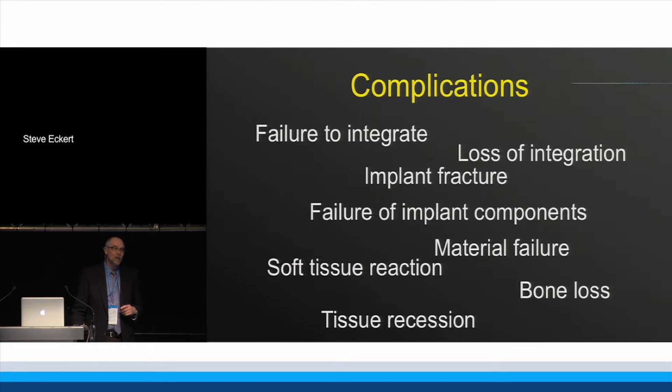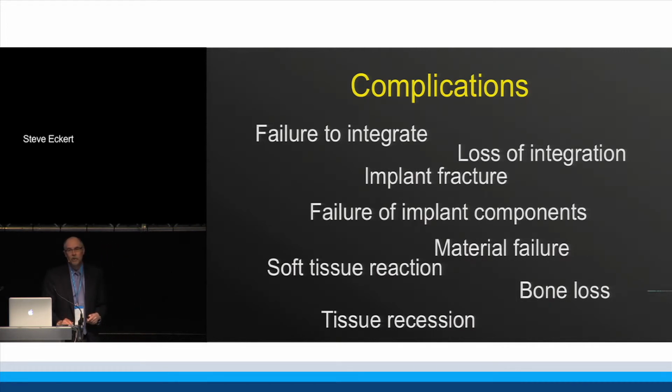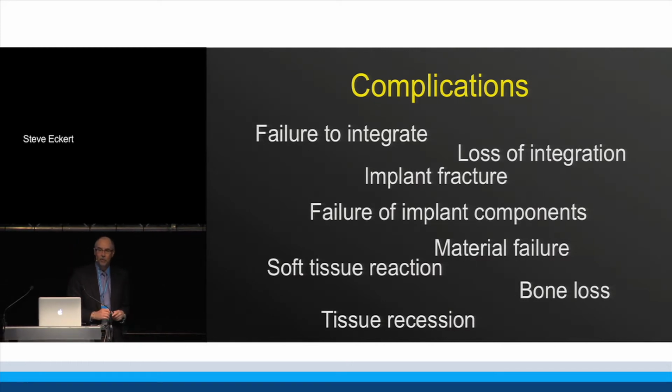Implant fracture is an even worse complication, because if you have an implant that's in function for a few years, the patient's happy with it, and then all of a sudden the implant fractures, now not only do we have a failed site, but now we have to create a bigger defect to remove that portion of the implant that remains in the bone, because there's a portion of the implant that's still integrated.